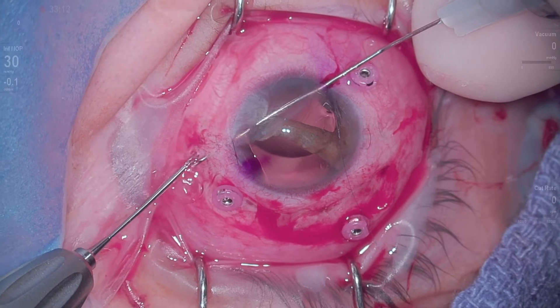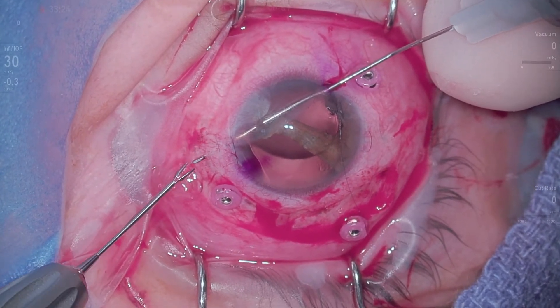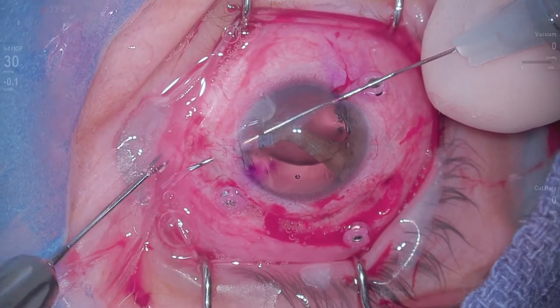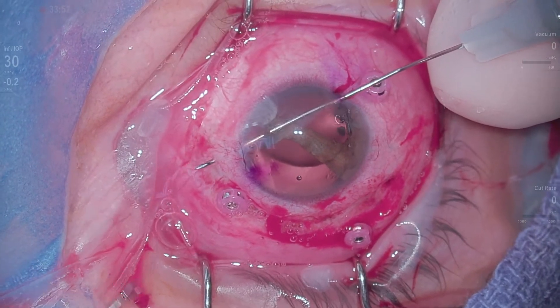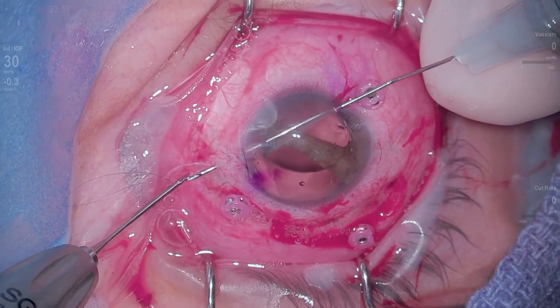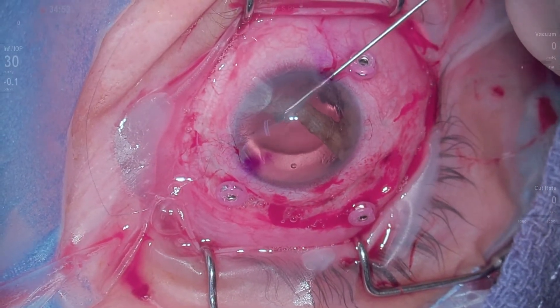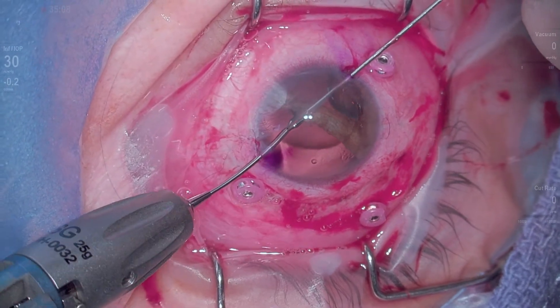I have sped this up because it was quite tedious, and I didn't want a 10-minute surgical video. I'm basically taking that proline right now and pulling it out, taking care not to pull it out of the needle — I want to pull the loose end. Now I've got that loose end out, I'm going to grasp it, go back in with the needle, and move over to re-engage a little iris adjacent to where I had just grabbed.